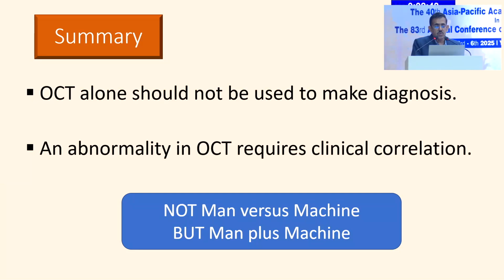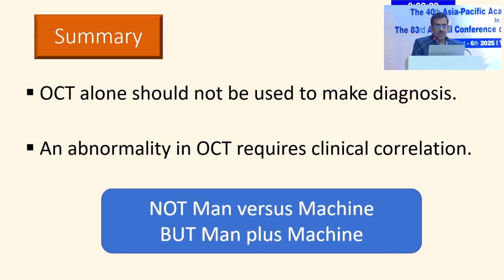To summarize, OCT alone should not be used to make the diagnosis. We should always make a clinical workup before we see all the parameters and then make a diagnosis. And abnormality in OCT requires clinical correlation. So it's not man versus machine, but man plus machine.